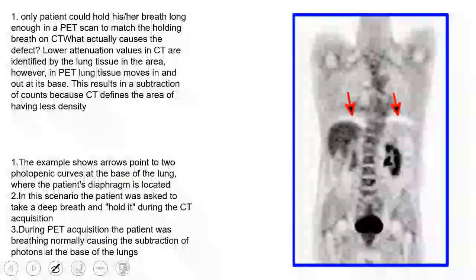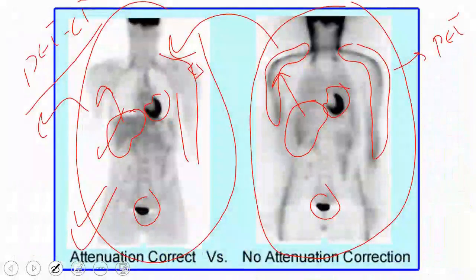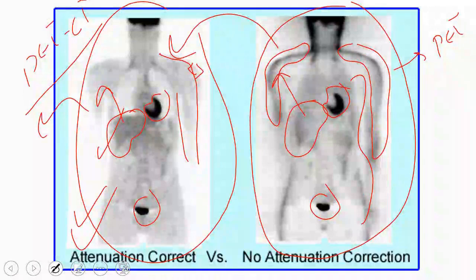The second function is that if you look at your image, you see that you are not exactly pinpointing. You see radioactive material and some black and white areas. If you are, of course, experts in CT anatomy, it shows you where the radioactive material is located exactly in the liver or in any loop in the kidney. So, the gamma camera image tells you how the activity distribution is, but the localization is where it is. Where exactly in the anatomy? Where exactly in the liver? Where exactly in the kidney? In the cortex? In the medulla? Or where exactly in the pancreas?